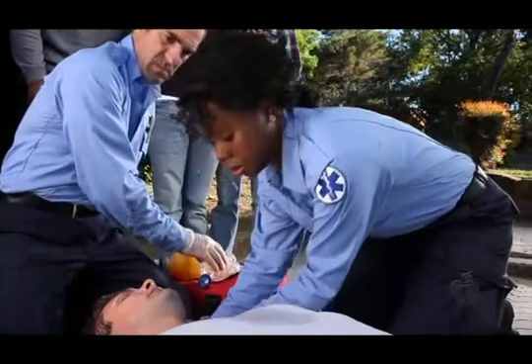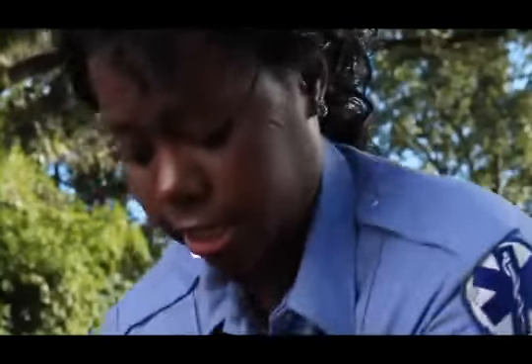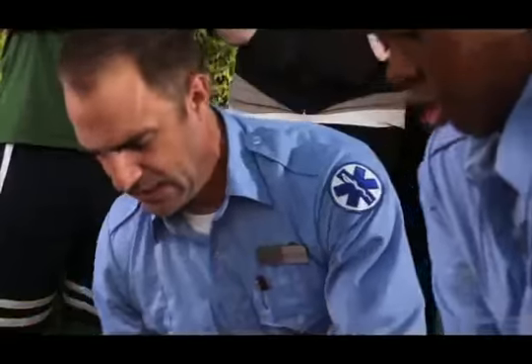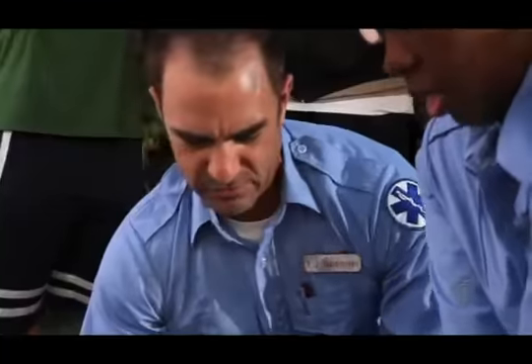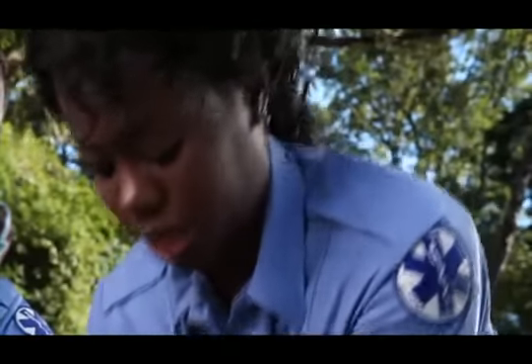There's no pulse. 1, 2, 3, 4. Remember, 5, 6, push hard 7, and fast. 9, at least 10, 2 inches or 11, 5 12, centimeters. 13, 14, his chest 15, needs to 16, completely 17, recoil 18, after each 19, compression. 21, 22, 23, 24, 25, 26, 27, 28.